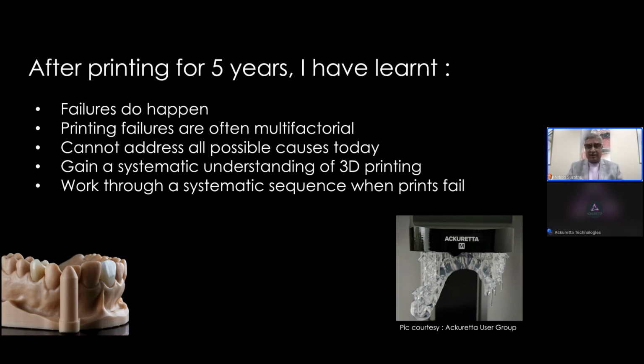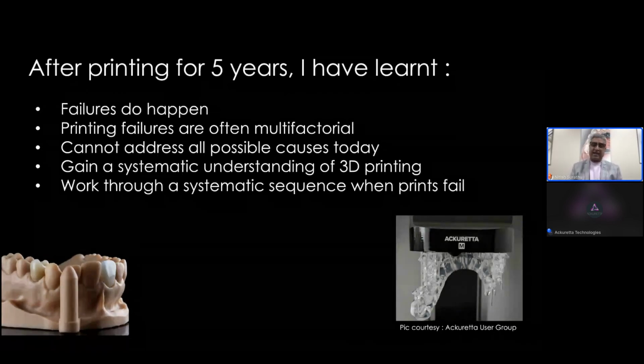You can pick the wrong resin profile and be printing in a completely different resin altogether. How do I know that? So there's all kinds of multifactorial reasons why printing failures can occur.